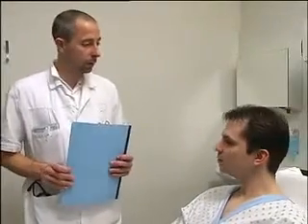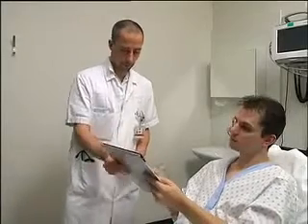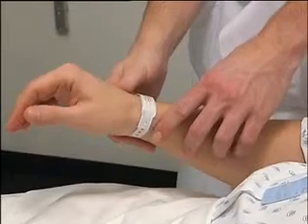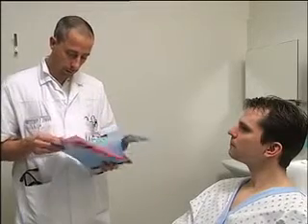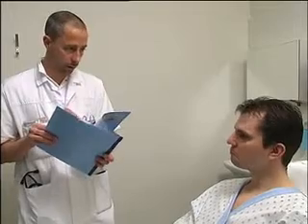Explain the procedure to the patient and obtain written informed consent. Confirm the patient's identity, the indication for needle aspiration, and the absence of contraindications. Confirm that the patient has no allergy to lidocaine and verify whether the pneumothorax is on the right side or the left side.